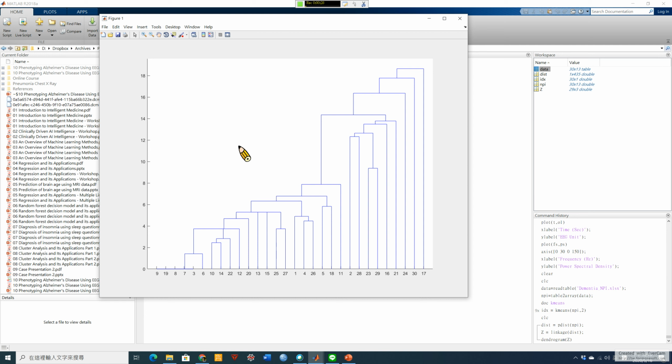The advantage of hierarchical clustering is that it does not have the randomized initialization problem, so the results should be stable with different trials and rounds. But the problem with hierarchical clustering is that sometimes it does not have a good ability to find out which two items or observations should be clustered into one group.